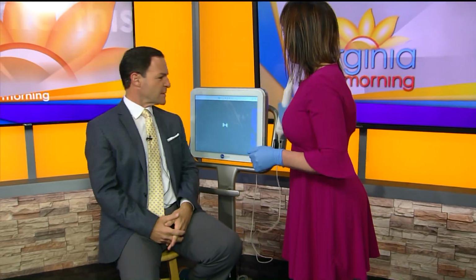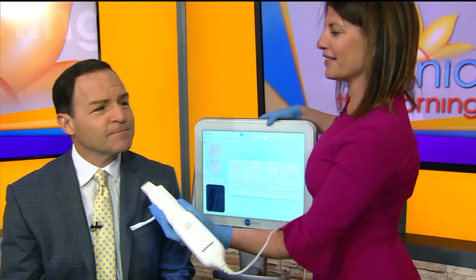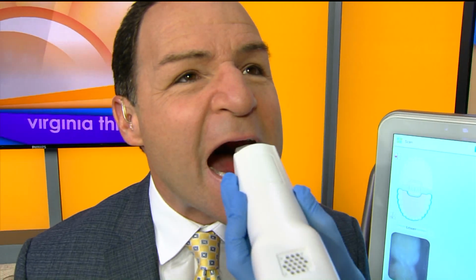Yeah, okay, so this is just the handheld device. We just want to get the teeth as dry as we can. I'm left-handed, but okay, does that work? Try to. All right. Bring this around so we can see, and you're just going to open really big, and we're going to hit the button, and you can see it's going to start just capturing his teeth as we just go around. He's such a good patient.